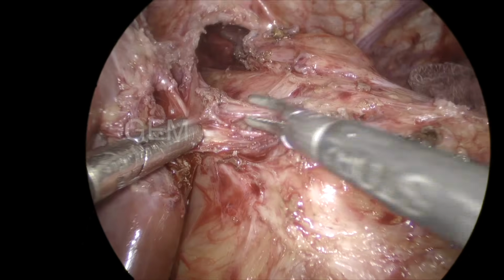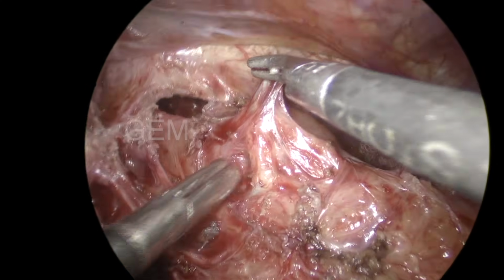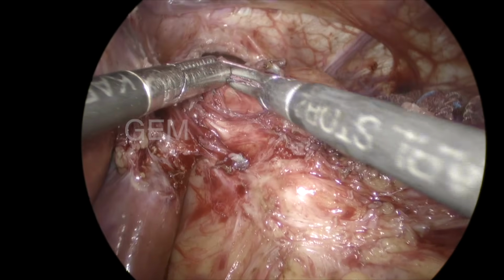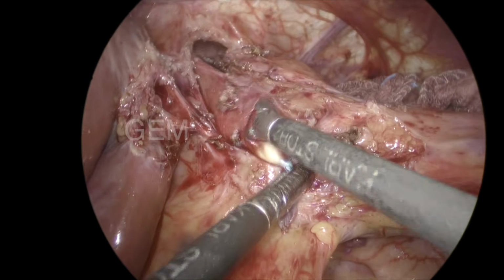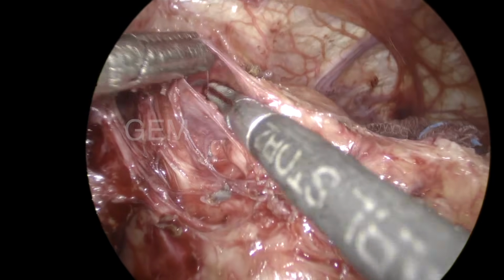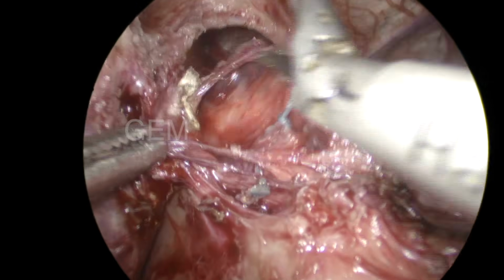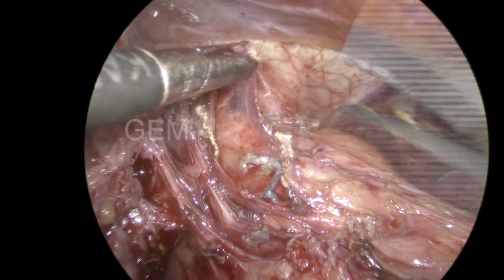So, a chronic case, a lot of fibrous adhesions. Again, some suture is there. You can appreciate all the polyester sutures. So again, you can see the fundus. So I cannot divide this because I should not injure the fundus. That's why I am dividing only the fibrous structure covering the fundus of the stomach.